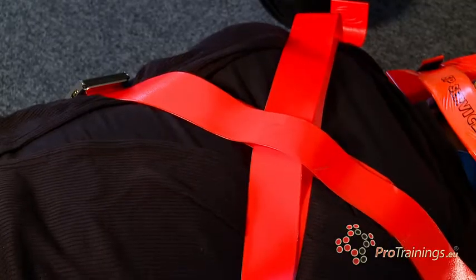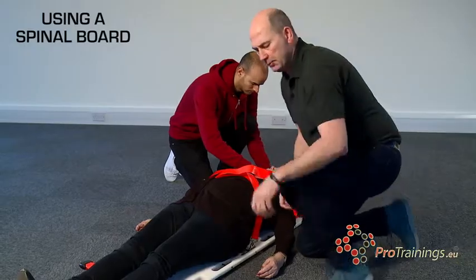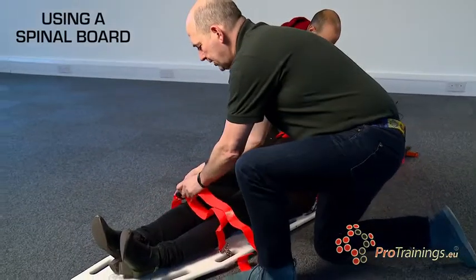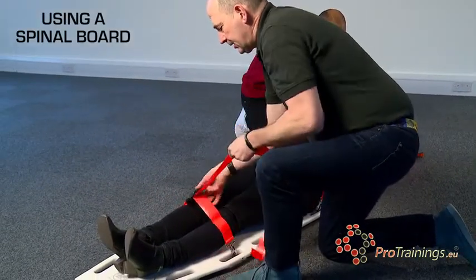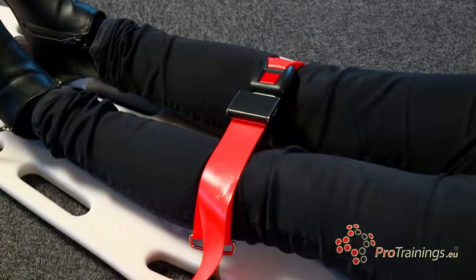The straps don't want to be so tight that they restrict breathing — they are just there to fix the upper torso to the board. We then move down and fit the final strap across the legs, pulling nice and tight so the patient is fixed solidly to the board.